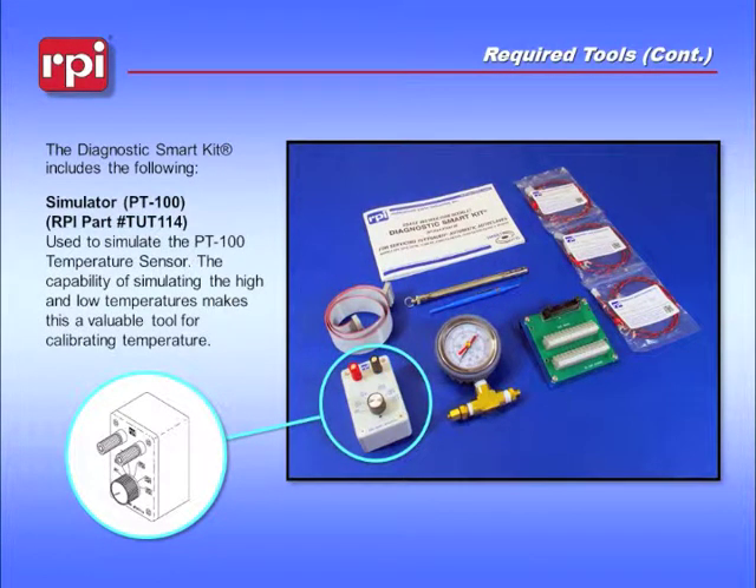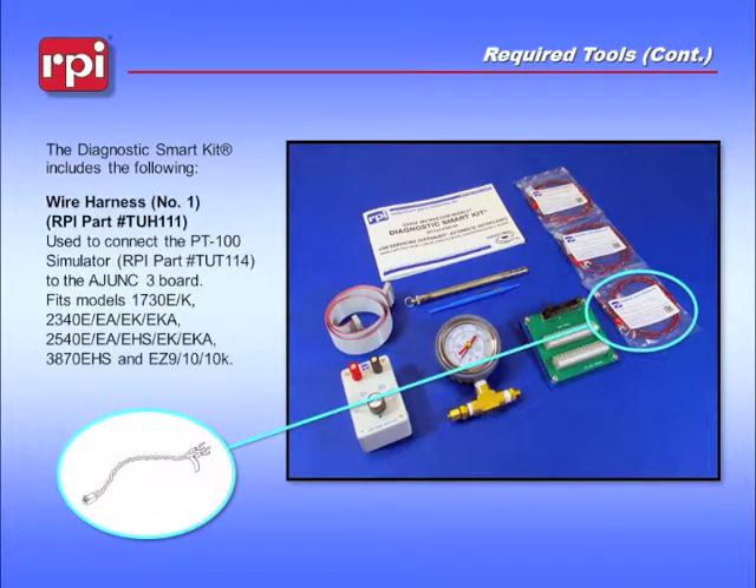The PT100 simulator, RPI Part Number TUT114, is used to simulate the PT100 temperature sensor. The capability of simulating high and low temperatures makes this a valuable tool for calibrating temperature. The first wire harness, RPI Part Number TUH111, is used to connect the PT100 simulator to the Adjunct-3 board.